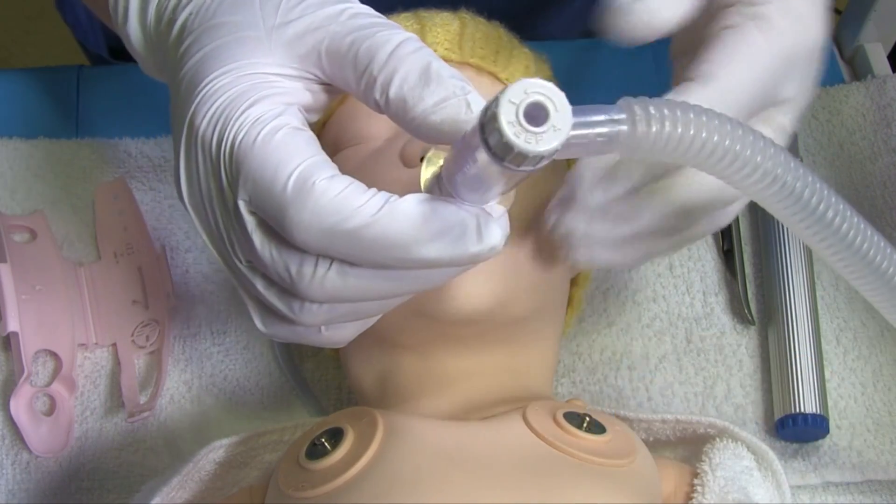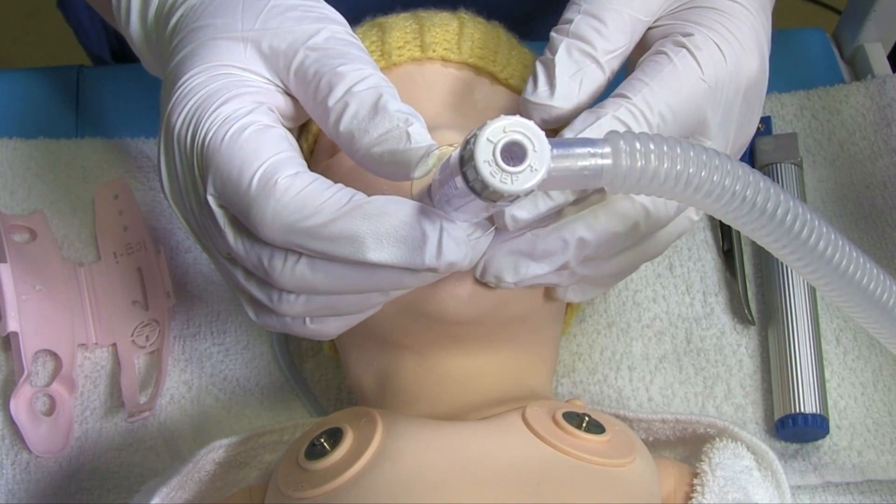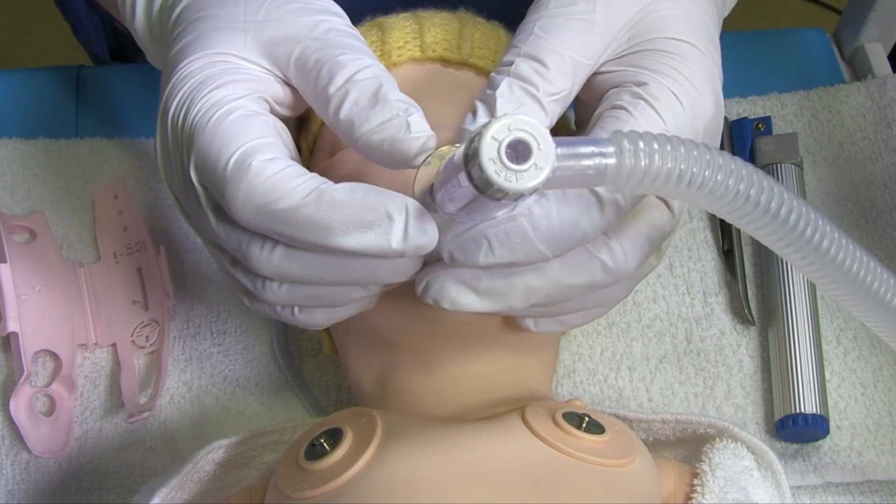This is the end of the insertion of a laryngeal mask into a baby's airway. Following on from the demonstration of insertion of an iGel, we now need to discuss correct positioning.